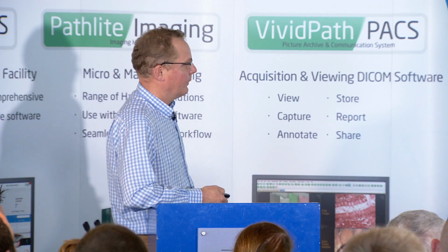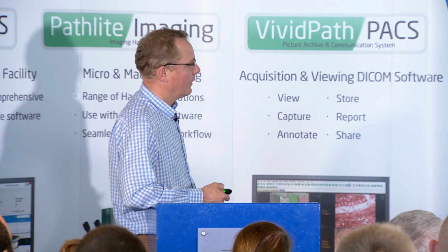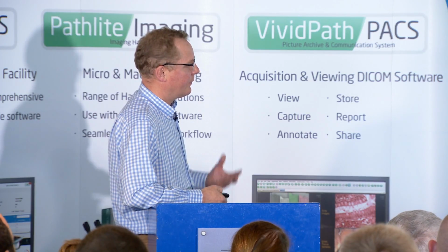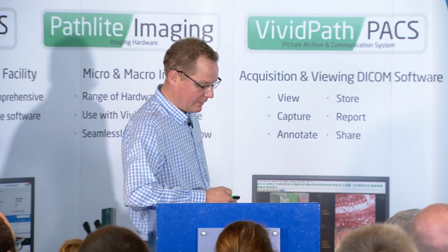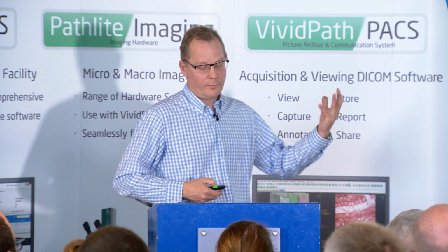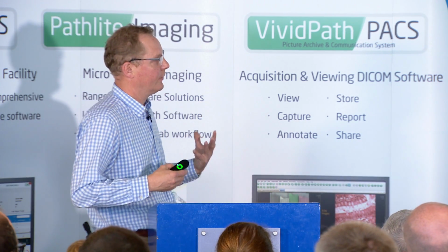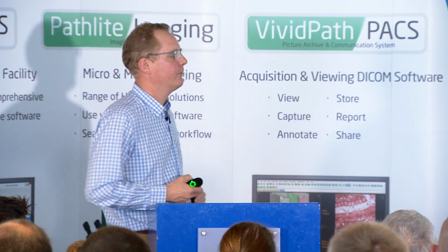And this was work which we did on colon cancer again. These are Dukes' B colon tumours, i.e. they've invaded into the wall but they've not metastasized outside the bowel. And this is a big problem group really of patients. In fact, there was an article in the paper the other day about prostate cancer, which reflects the same sort of dilemma.